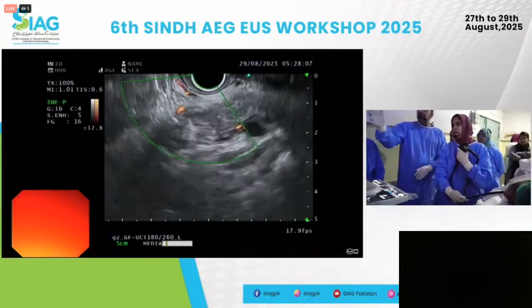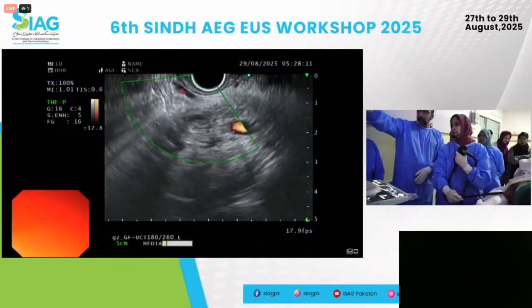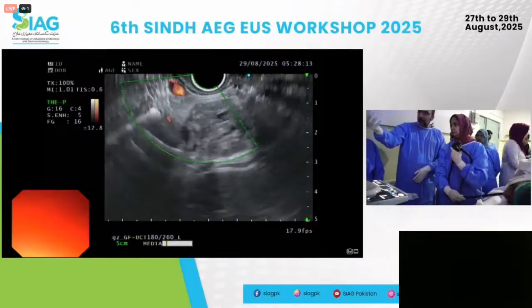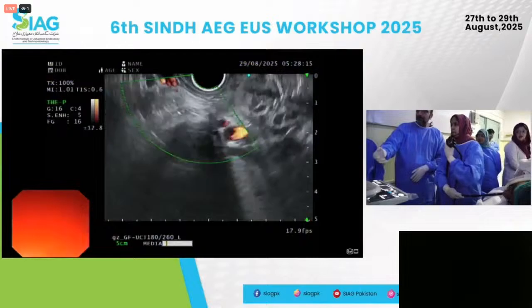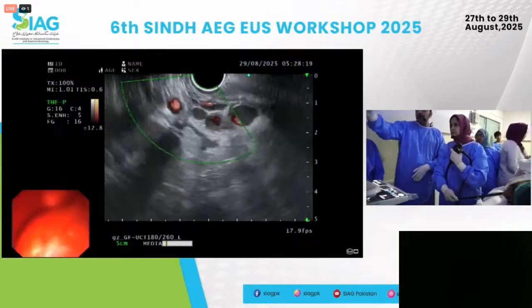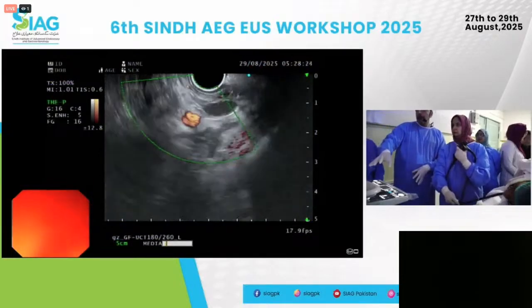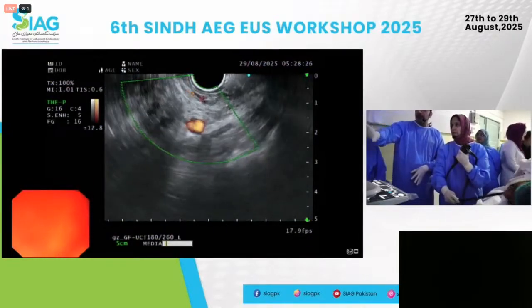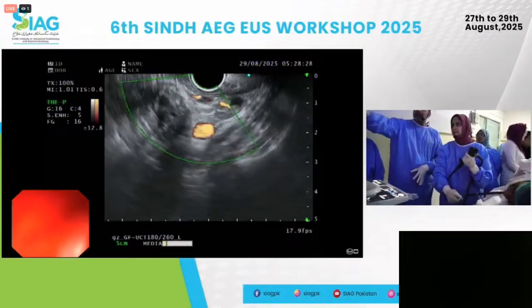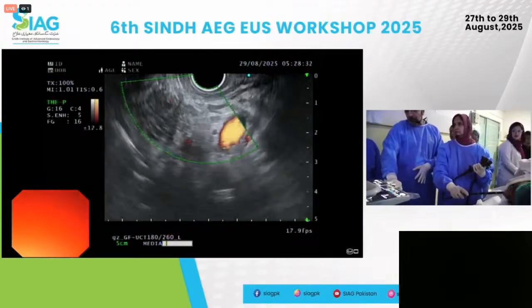The other thing we can do here is, you know that you have pancreas, right? So pull back, show us the splenic vessels here. So pull back where you would expect to see the splenic vessels. Okay, good. Now go counterclockwise. So stay on the pancreas for a second. One thing is if you see something like this, my point is that what we want to do is look at the Doppler flow.